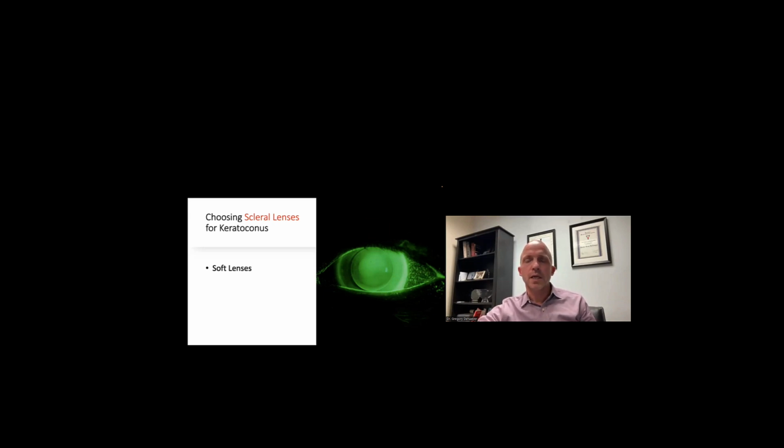and the other eye they wear a scleral contact lens. As the patient becomes more advanced in keratoconus, we have the ability to lathe cut individual soft contact lenses, which allows them greater sagittal depth to fit steeper eyes, as well as extended power ranges, including a really high cylinder amount. So this type of lens, soft contact lenses, are still an option for patients with mild keratoconus.